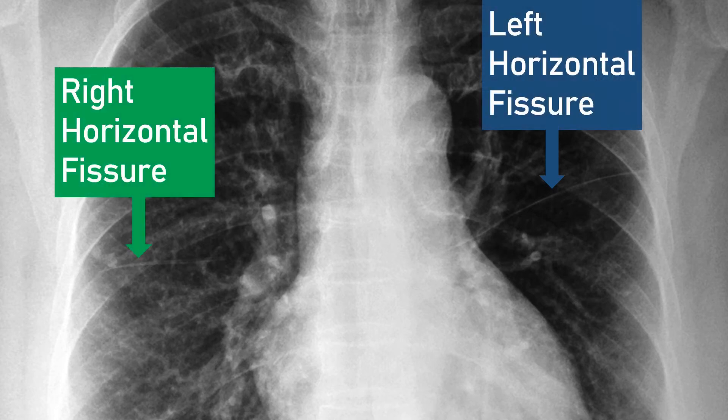On frontal radiographs, this accessory fissure resembles the right horizontal fissure, except that it may be higher or lower. Like the right horizontal fissure, it can become clearly visible on plain film by airspace opacification or pleural effusion.